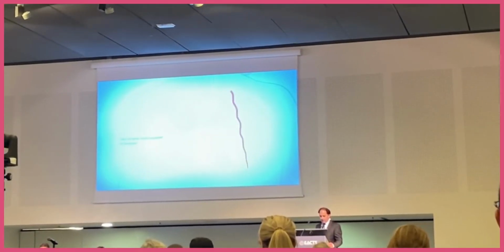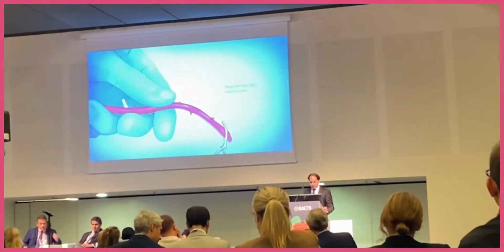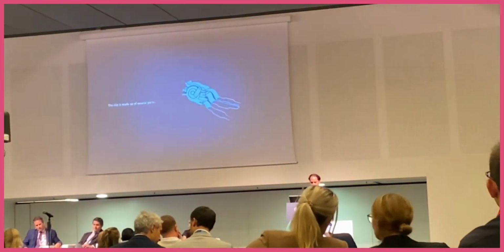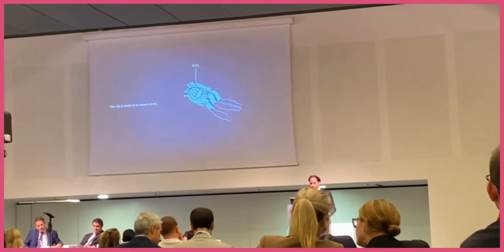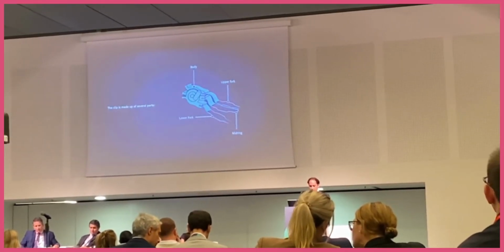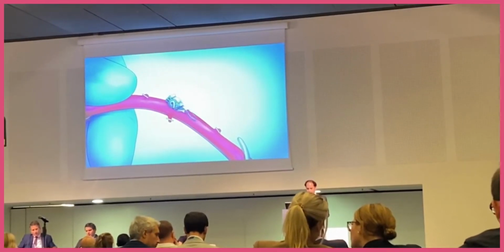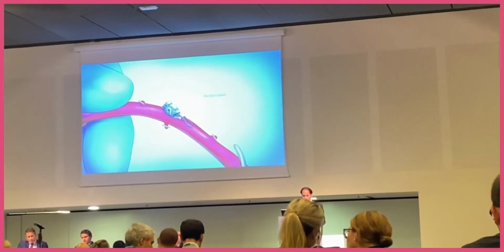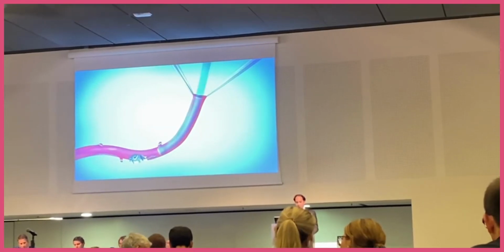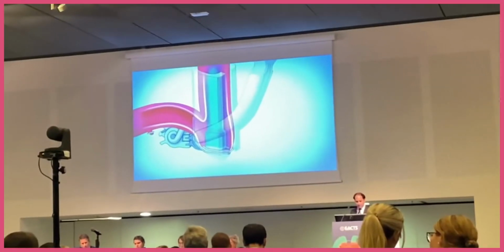So the chest opens and the IMA is harvested. This is control of the vessel, and then here comes the heart clip. It consists of several parts: a body with a spring, an upper fork, a mid ring, and a lower fork. The upper fork is open to the graft. The clip is closed. We have proximal control of the vessel, opening of the graft, and introduction of the laser catheter, which goes into the mid ring and is then stabilized by a fixating device.